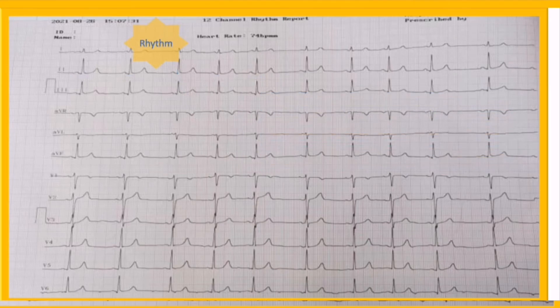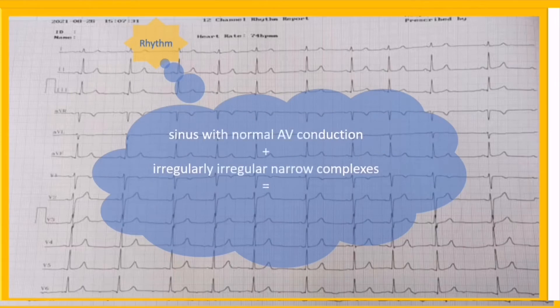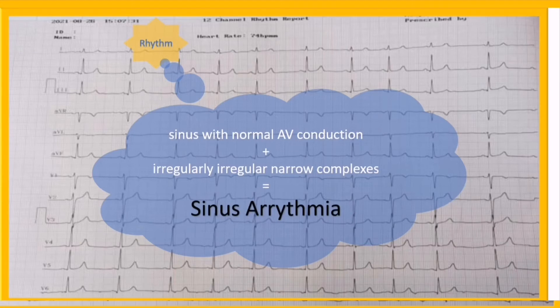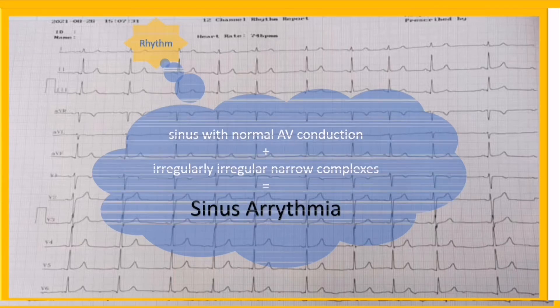There is no dropped beat, so the AV node is healthy and no AV block exists. The PP interval and RR interval here are variable and considered to be irregularly irregular. In summary, the rhythm is sinus with normal AV conduction and irregularly irregular narrow complexes due to variability in RR interval — therefore the underlying rhythm is sinus arrhythmia.